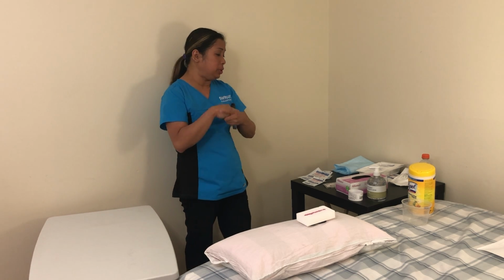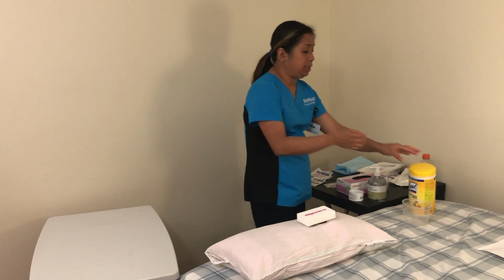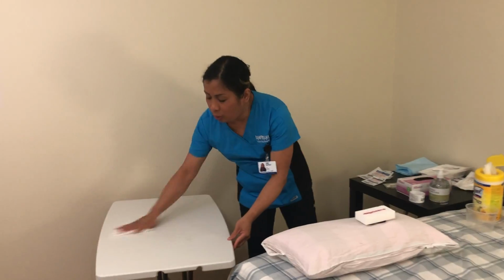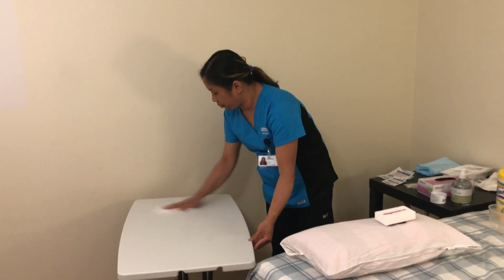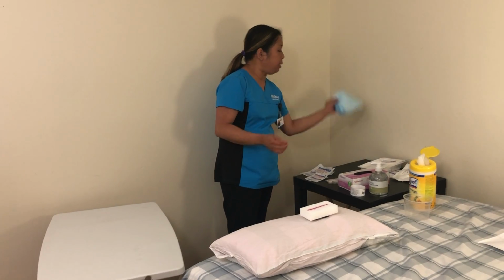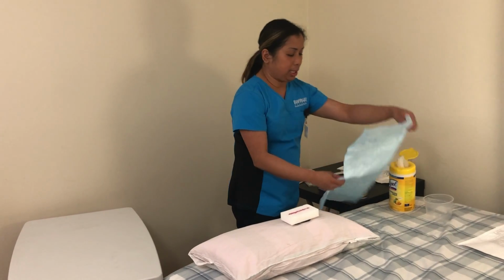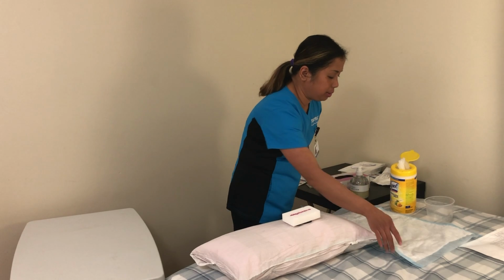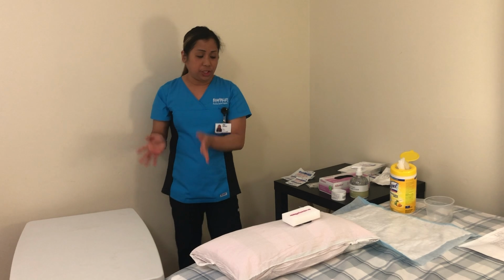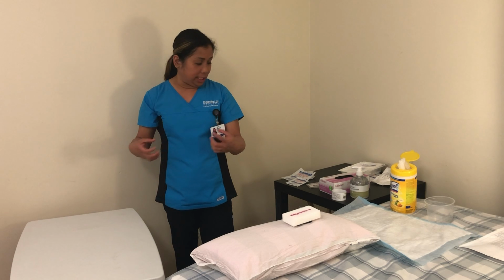So what should I do? I would clean up my table first using my disinfectant wipes. I will discard this one, and then I will put my underpad below the legs of my patient. Okay, so after that, this is the position of my working table.